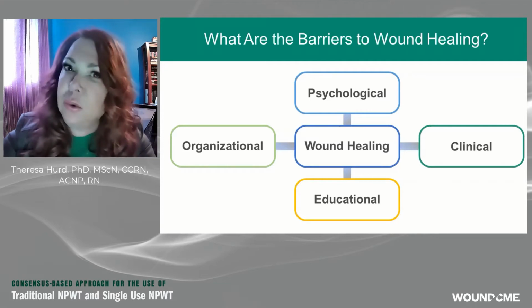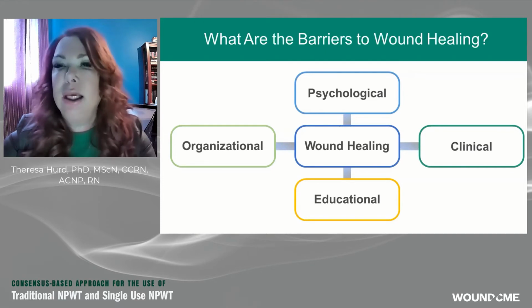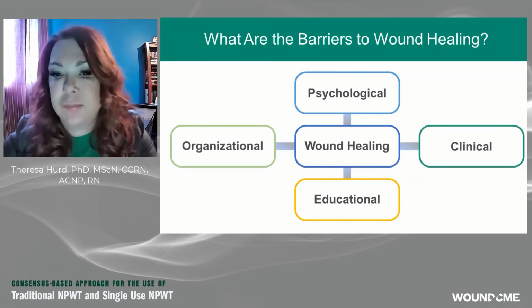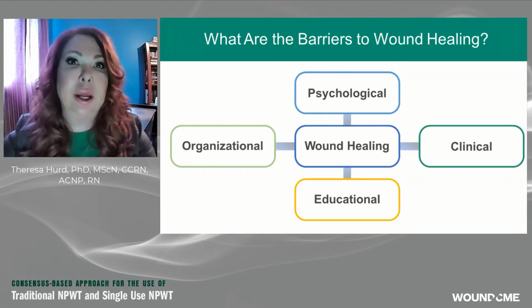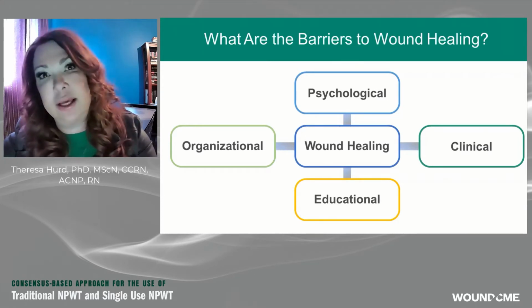And we have found with negative pressure that there can be an inconsistency in the education across large organizations. And of course, that will spill to the patient as well and cause problems with the patient. And this, of course, is something we look at when we look at education and the type of treatments we're providing for our patients.